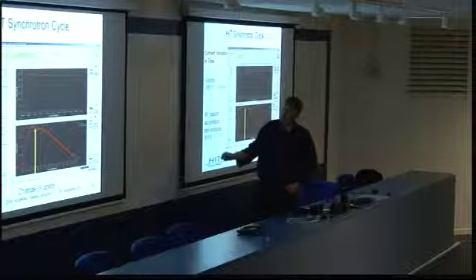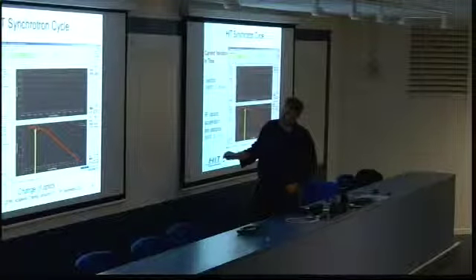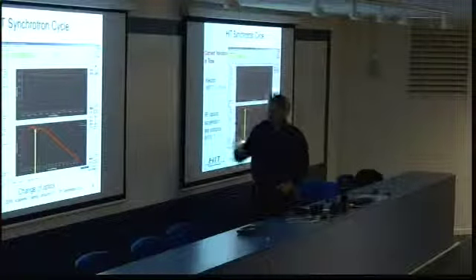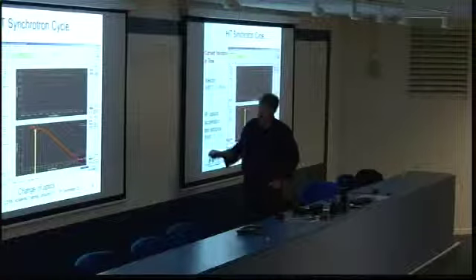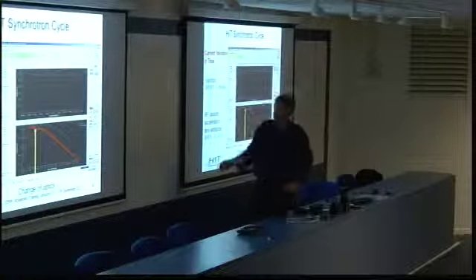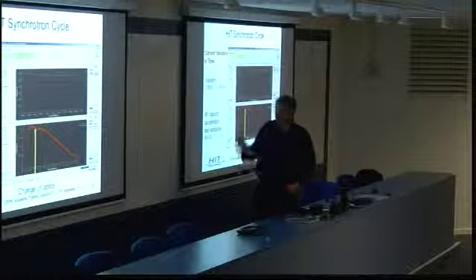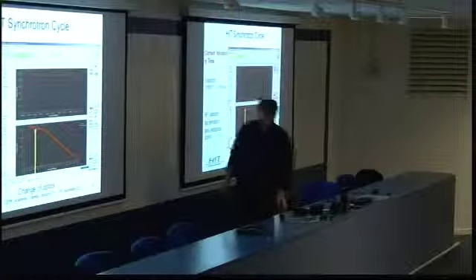Okay, you see the time which goes along. So altogether, one cycle is about 7.5 seconds, and then you have a gap for some control system things which we have to do. And so altogether, our cycles are in the order of 8 to 10 seconds.